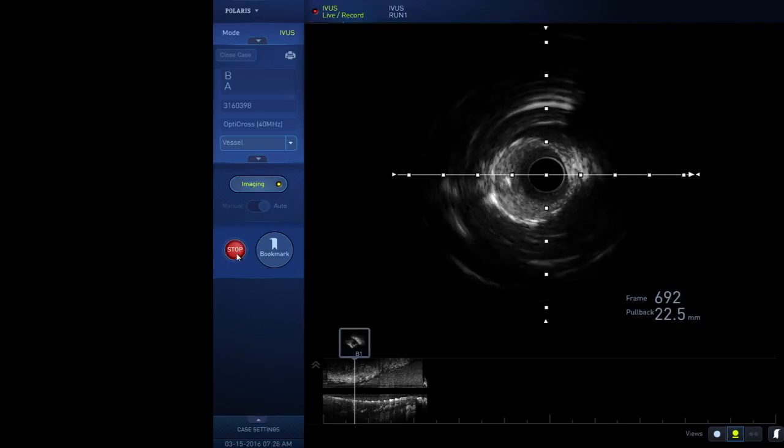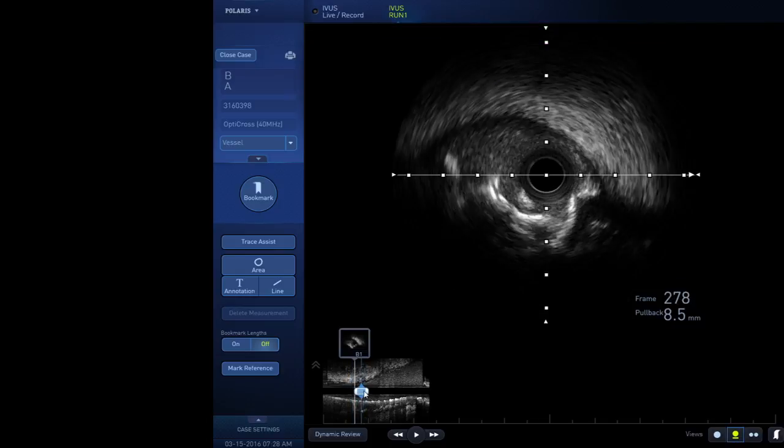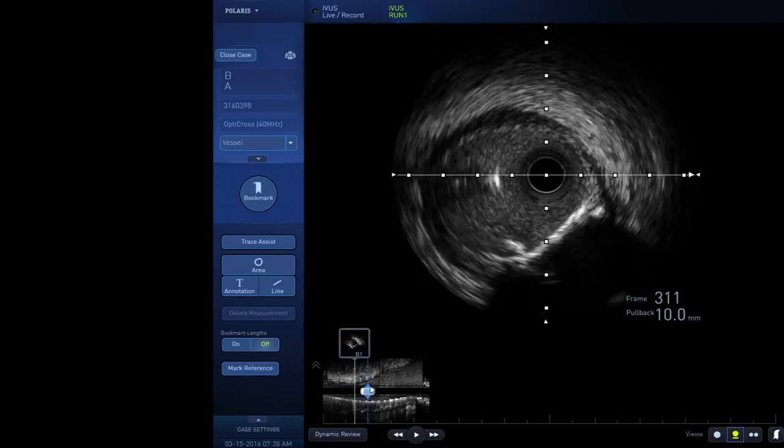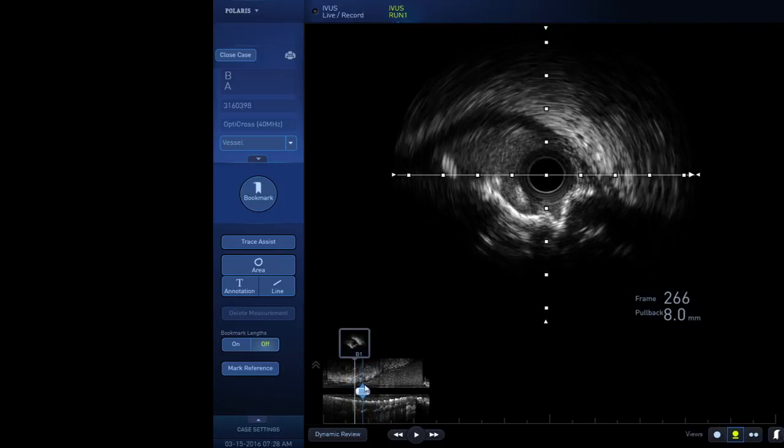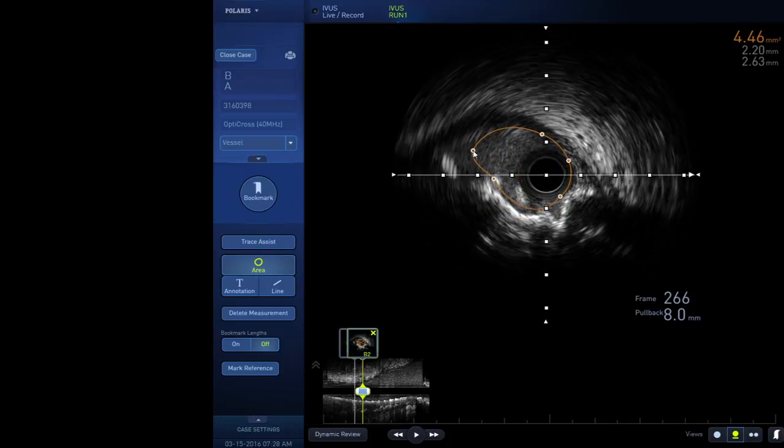What are the chances that you can make a turn into the circumflex? You need to leave it there and just see if the wire can go. I think you will need a specialty wire to make that turn. Let's see if this wire can go, and you can leave this inside. Why do you need to go into the circumflex? No, can we make it or not? I mean, truly, I always say, if you are heavily calcified, don't do any of this imaging technique because that can make the patient even more unstable.